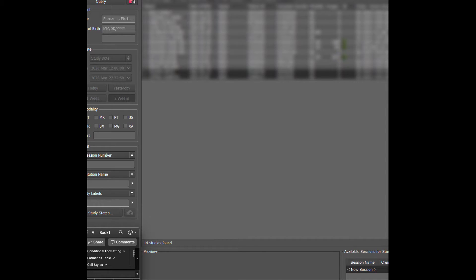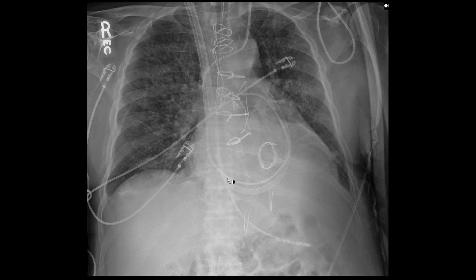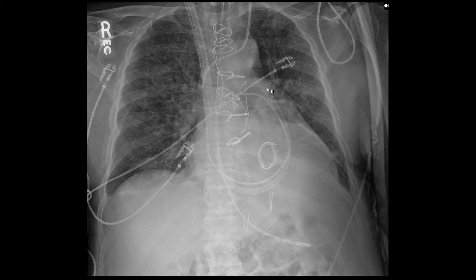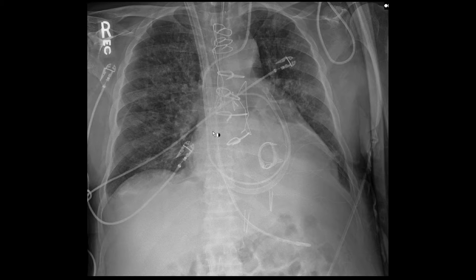For right ventricular assist, there is a device called the ProtekDuo, which enters via the internal jugular vein with two lumens, going into the right ventricle and right ventricular outflow tract. The outflow portion extends into the outflow tract, and the inflow is in the region of the right atrium where the second lumen sits. As these devices evolve over time, understanding the physiology helps you determine where inflow and outflow should be positioned.